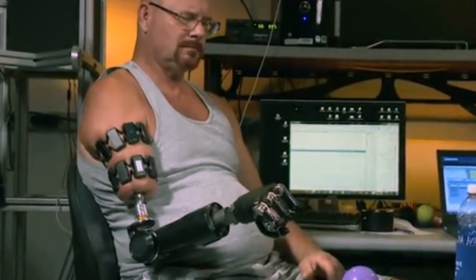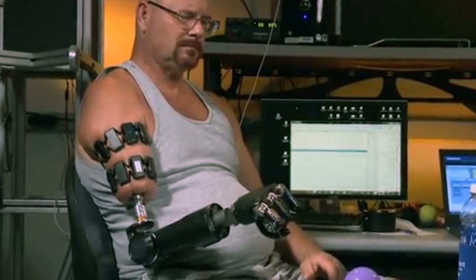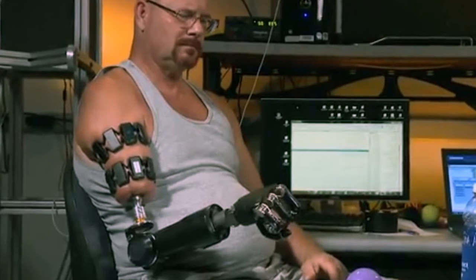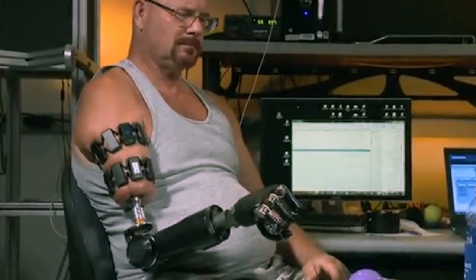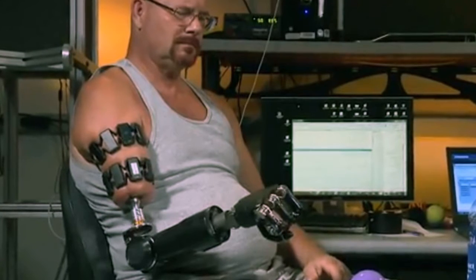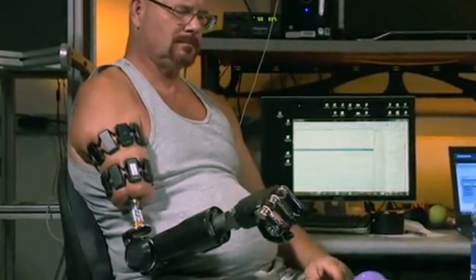Johnny Matheny lost his arm to cancer in 2008, and has since pioneered the advancement of arm prosthetic technology. The new system replaces the need for harnesses when working with the modular prosthetic limb, MPL, which can be uncomfortable after prolonged wear. For Matheny, it has helped to return many natural motions.